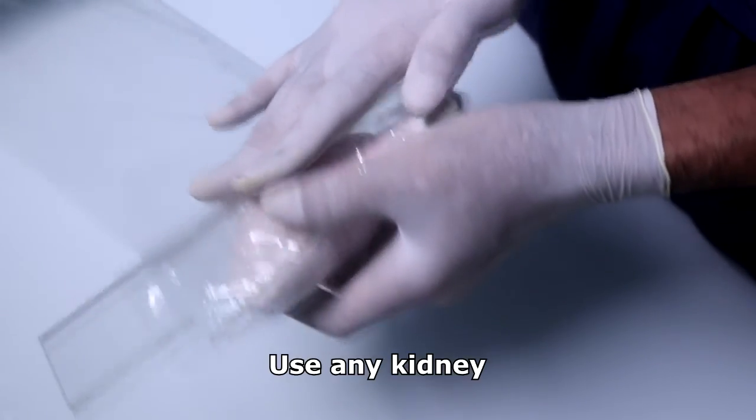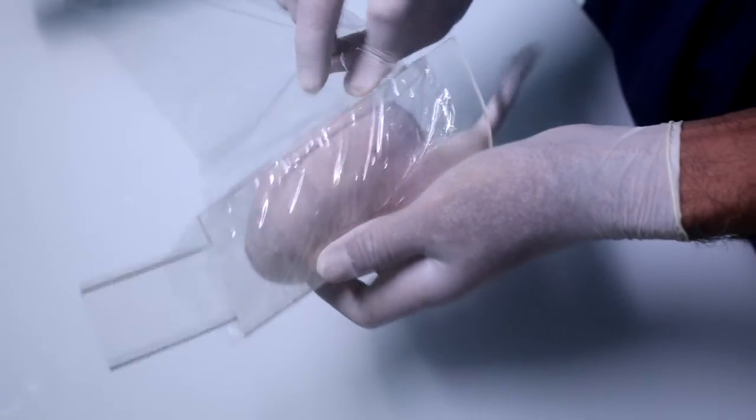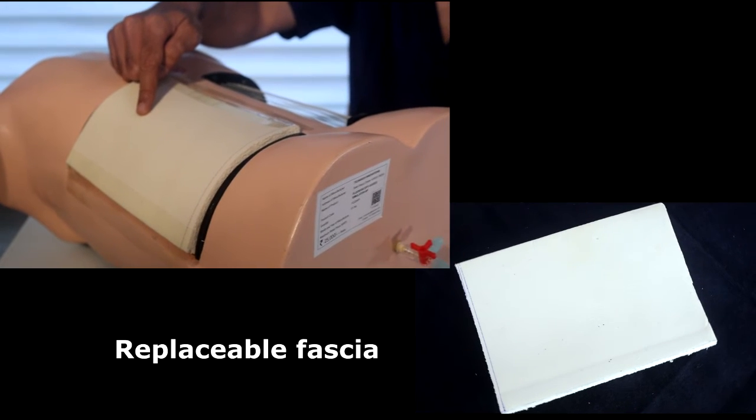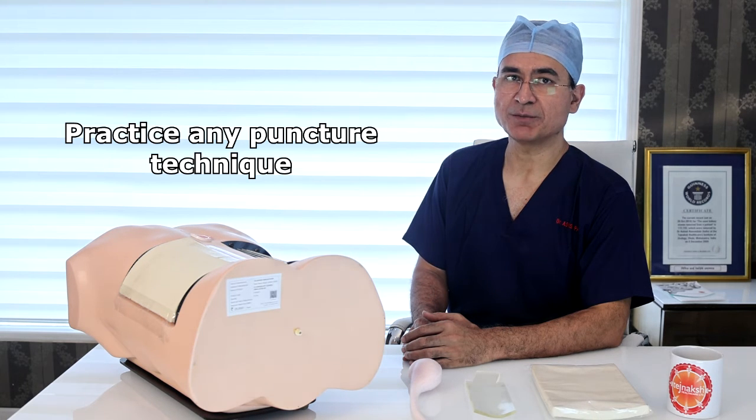Any other kidney, like a bovine kidney, porcine kidney, or a 3D printed kidney can be used in its place. Also, each of the fascia is replaceable and affordable. The seam is quite humanoid and can be used for prone or supine PCNL puncture.